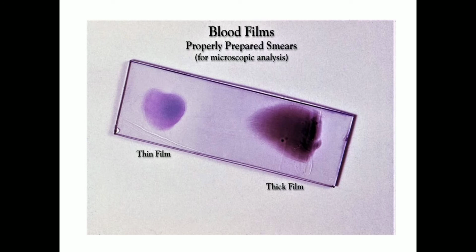Now we are going to discuss how to prepare both thin and thick smears. You can see the slide here. You can do both preparations on one slide, or on separate slides as well. There is no issue, either is fine. This is how we prepare a smear for microscopic analysis to detect the parasite.